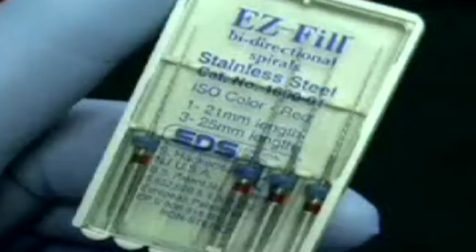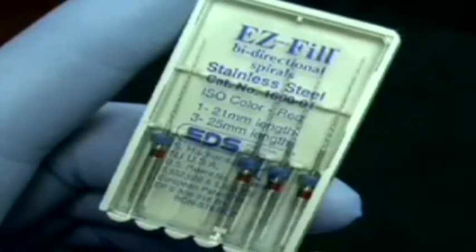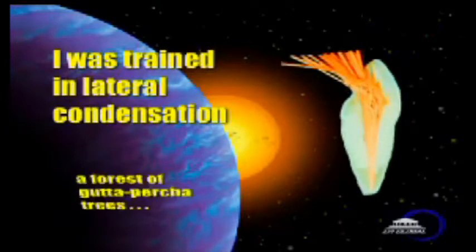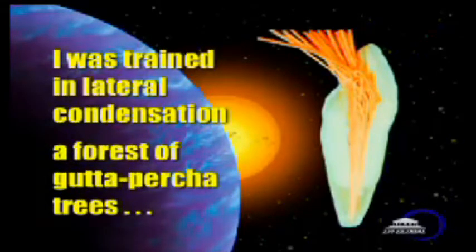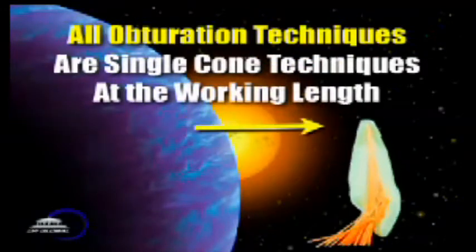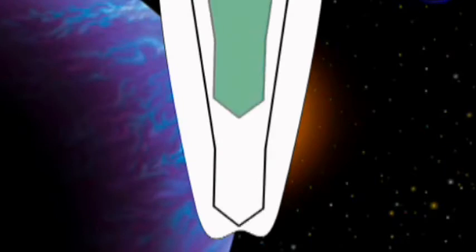The complete obturation technique uses the EasyFill bi-directional spirals. It is a single cone technique. I was trained in lateral condensation, where we would place as many cones as possible into every tooth, but every obturation system on the market is in fact a single cone technique in the last millimeter of the preparation. So here's what we do: we fill the canal with sealer, place our master cone that's already been pre-fitted down in the canal, and here's the final fill — gutta-percha in place, and we see what a nice dense fill we have.